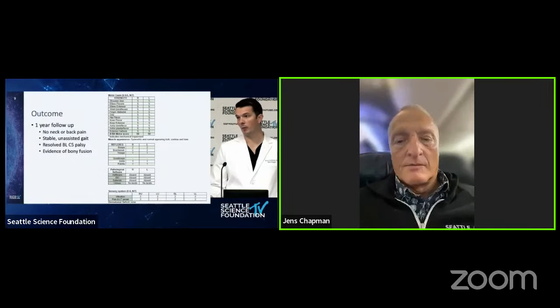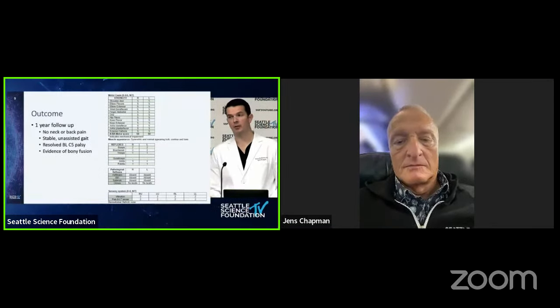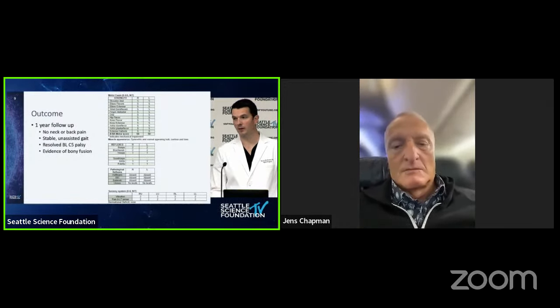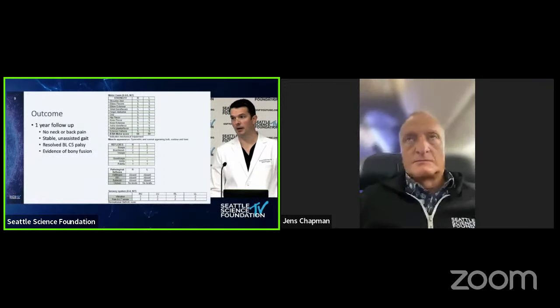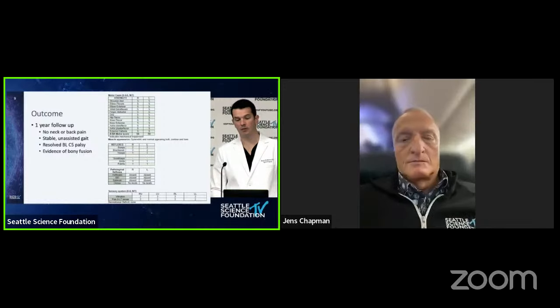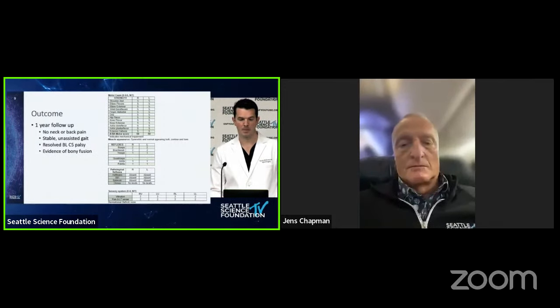She was very high risk for the C5 palsy, and she was counseled preoperatively extensively about the different options, the risk factors, and especially the C5 palsy. So it was something that was known going in. The good news is that at her 1-year follow-up, somebody with pretty advanced myelopathic signs is walking unassisted, has a great gait pattern, and has complete resolution of her bilateral deltoid palsies. She did very well, as you can see on the slide. And this is her 1-year follow-up showing great fusion.